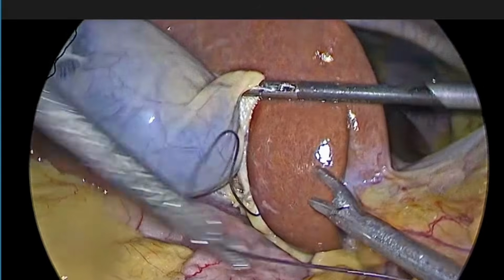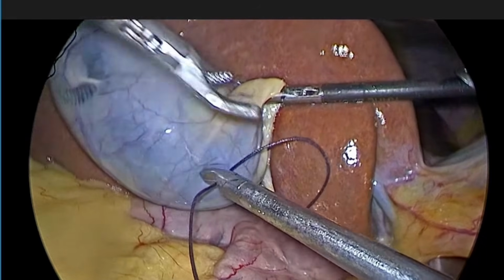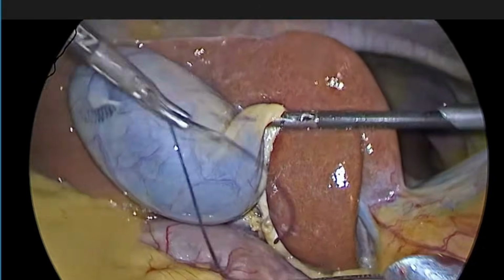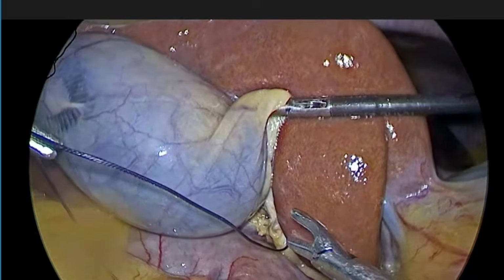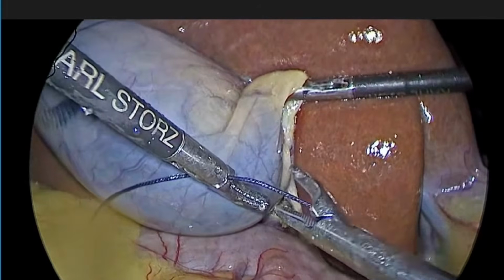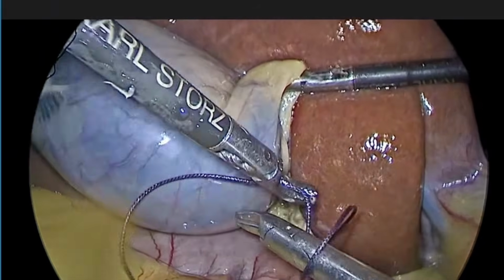We do not want to pull much. In that case, it can cause a Y effect. Our suture is a bit longer. I think that is not a good thing. It is my fault. No problem.